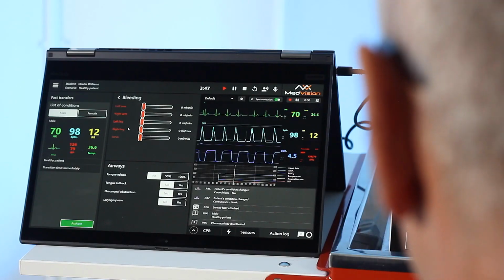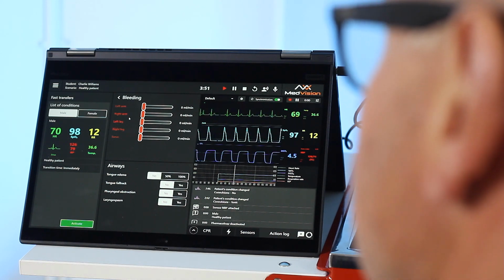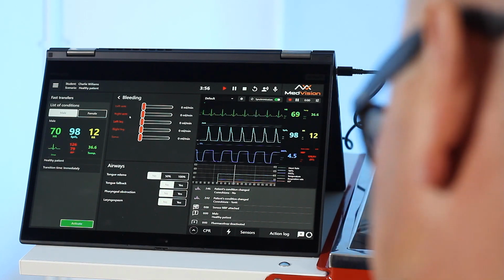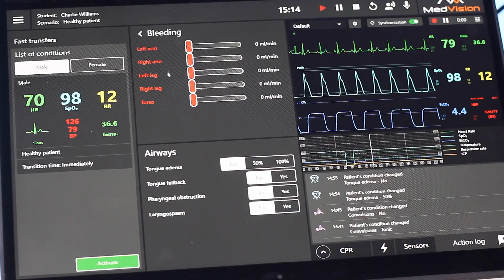Leonardo also has a bleeding module, so he has two tanks built within him, one to carry fluids and one for his bleeding modules. And these bleeding modules are attached, and then you can control the bleeding with the scroll here, and you get active bleeding and you can stop it as well.